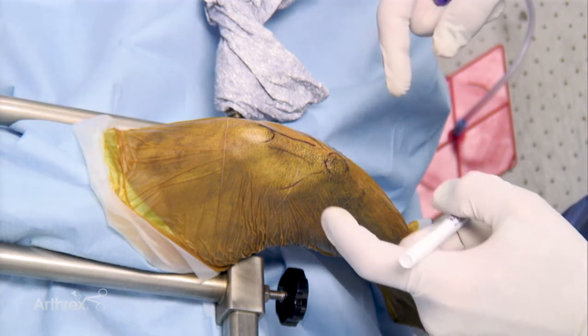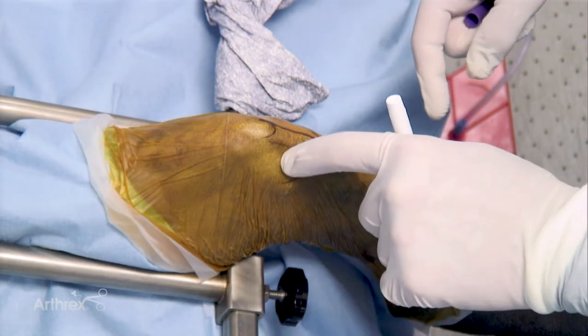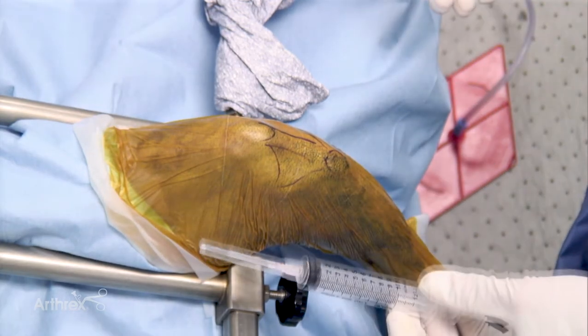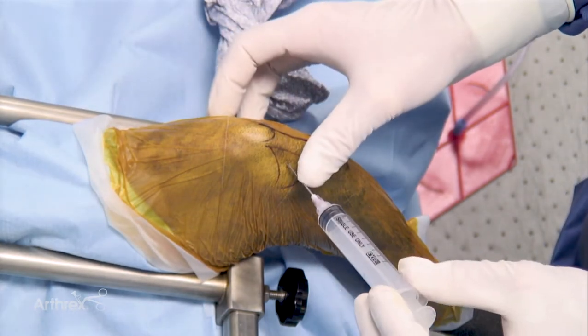We initiate our process with a medial arthrocentesis. The medial joint space can be palpated adjacent to the patella tendon and the femoral condyle. Using an 18-gauge needle, one can place the needle into the joint.